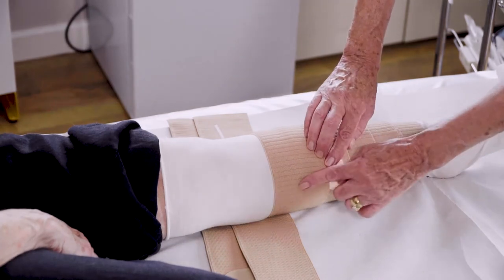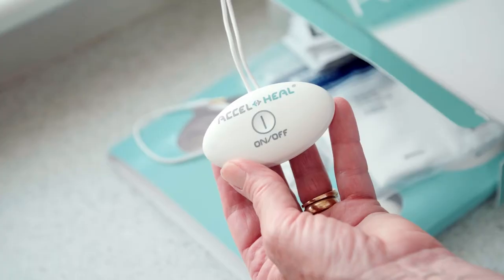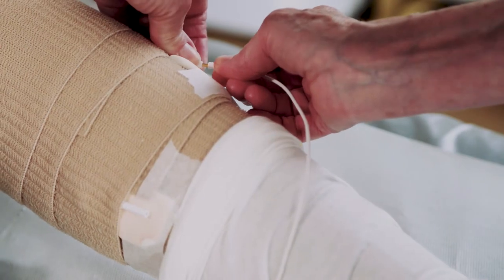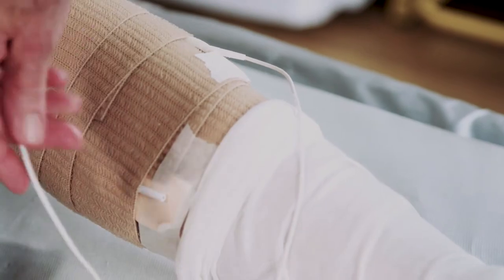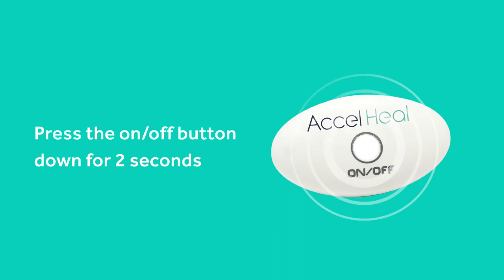Once you have applied the wrap, you are ready to connect the Axel Heal device to the electrode pads. Connect the treatment device to the electrode pads by pushing the electrode connectors into the electrode pad receptors. Activate the treatment by pressing the on-off button down for two seconds.